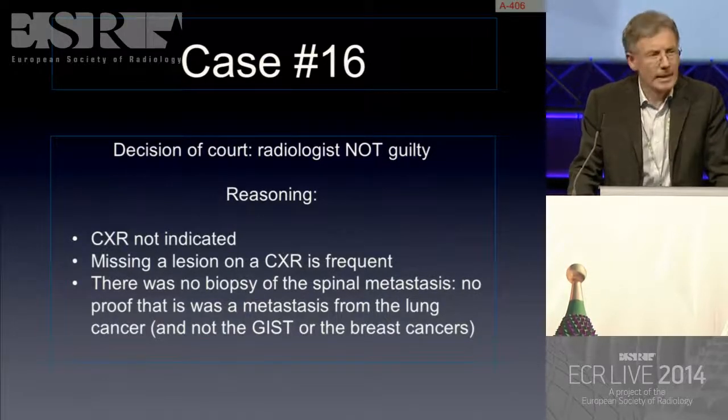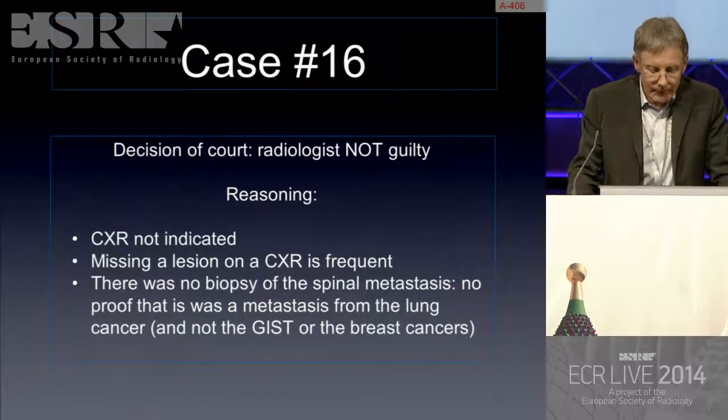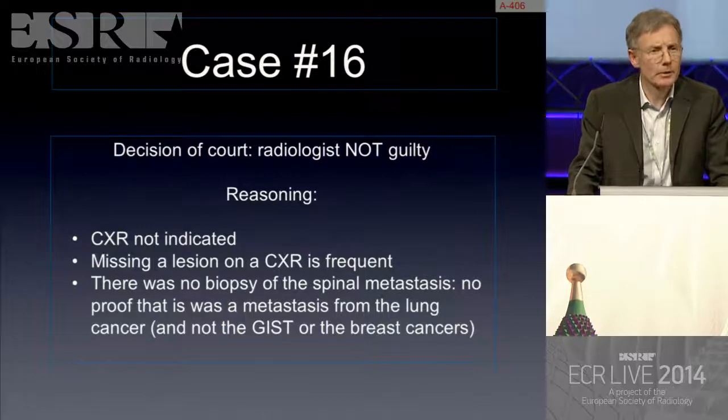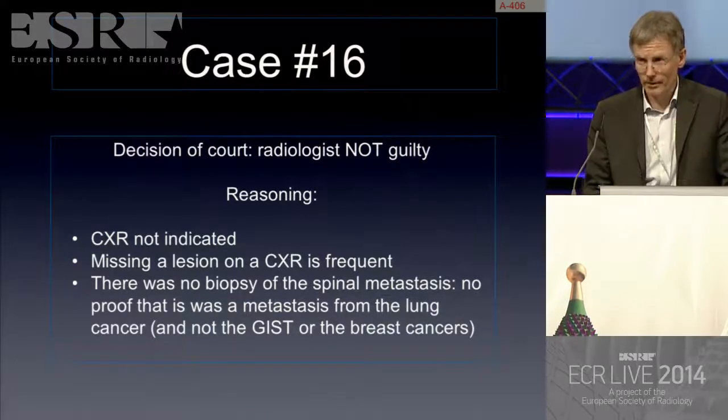Then, missing a lesion, as we've seen this afternoon on a chest X-ray, is frequent. And there was no biopsy of the spinal metastasis, so there was no way of proving that it was the lesion in the lung cancer which caused the metastasis, and not one of the other 2 tumors of the patient. So the radiologist was found not guilty.